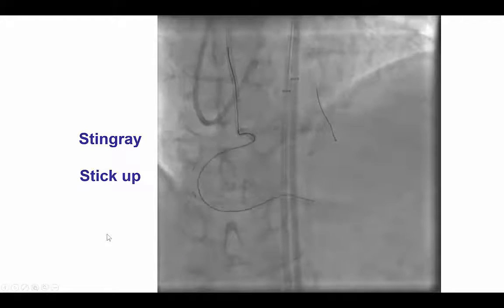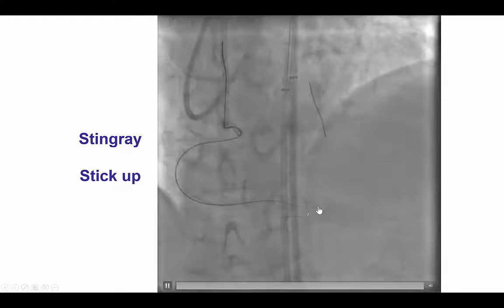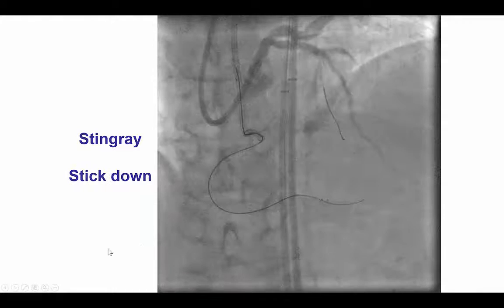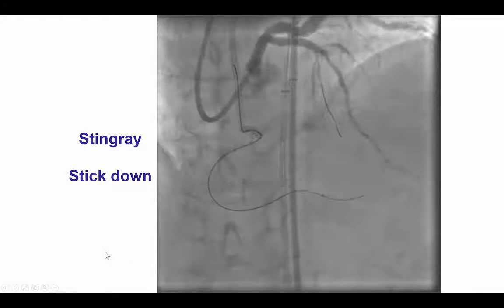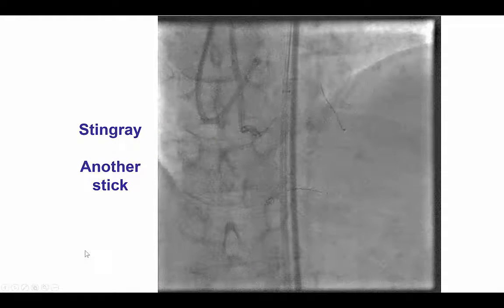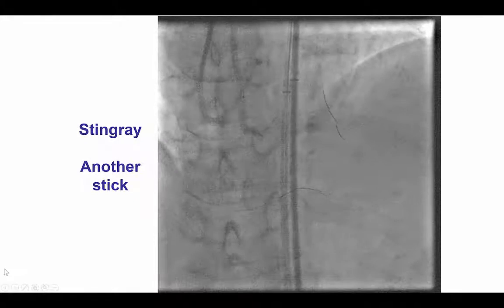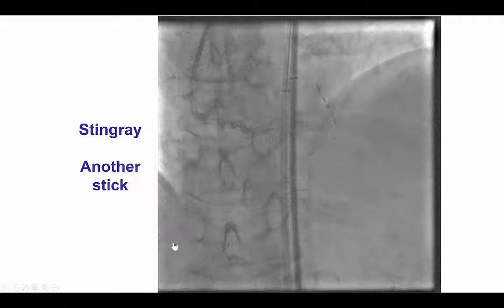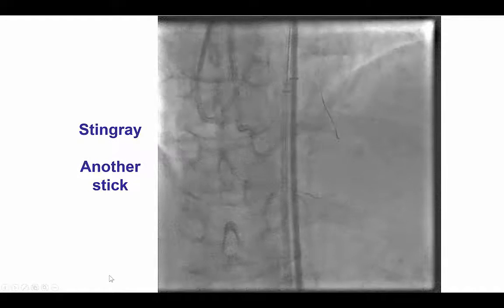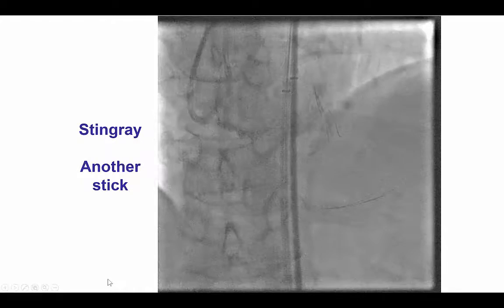We then attempted reentry using the Stingray system. We used a double blind stick and saw sticking up as well as sticking down. However, we were not able to achieve reentry. We tried once again with multiple attempts, but the wire did not seem to be going in the right place.